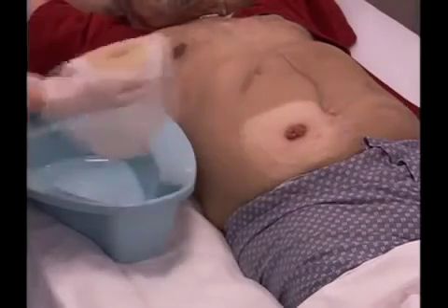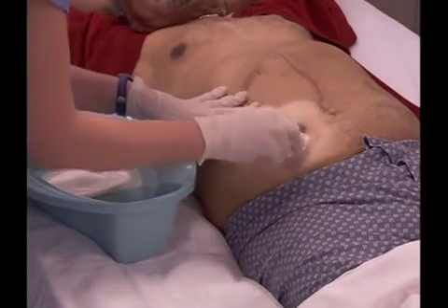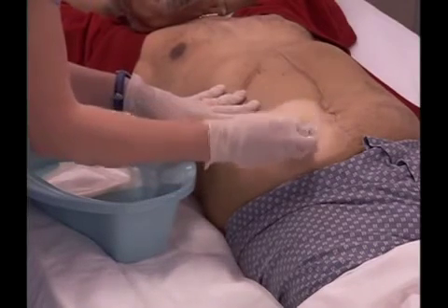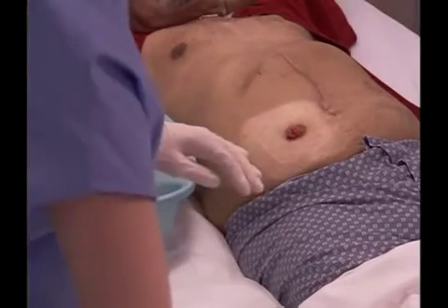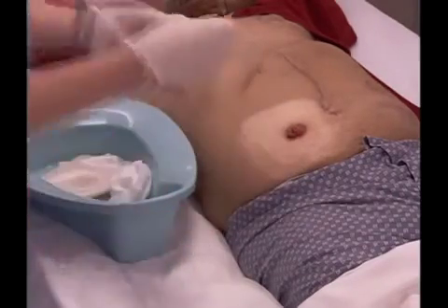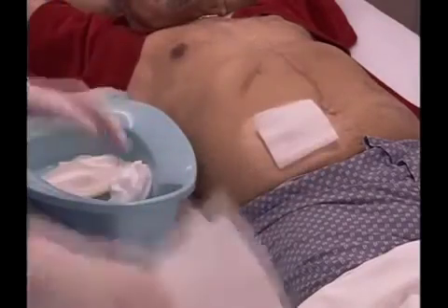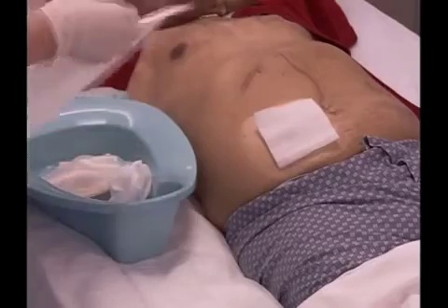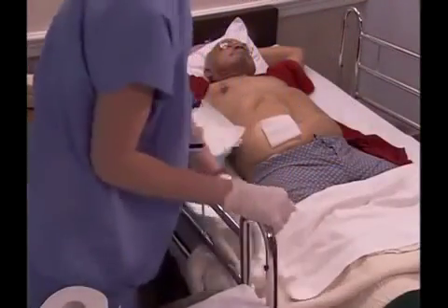Place the ostomy appliance in the bedpan. Gently wipe the stoma with toilet paper to remove any feces or drainage. Place the toilet paper in the bedpan. Cover the stoma with a gauze pad to absorb any drainage. Cover the bedpan with the bedpan cover or paper towels. If the side rails are in use, raise them before leaving the bedside.